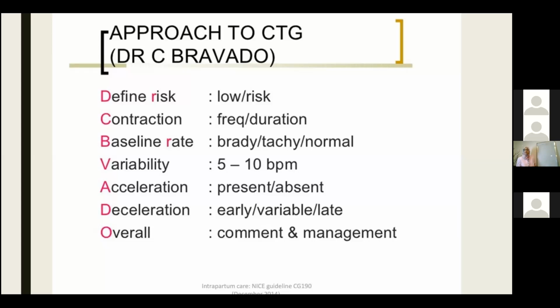Oh, she's diabetic. Oh, she's got a small baby. That's why she's on a CTG. So this is the meaning of defined risks. The C in Dr. C.